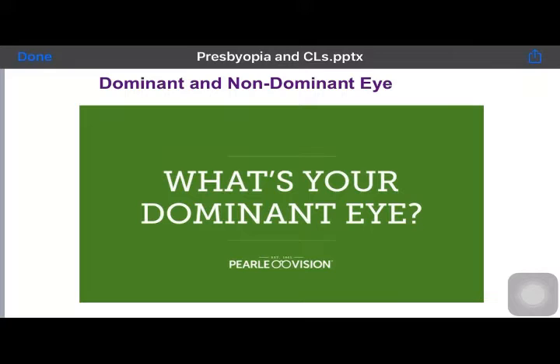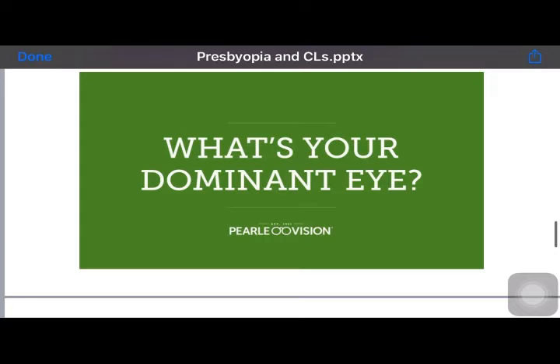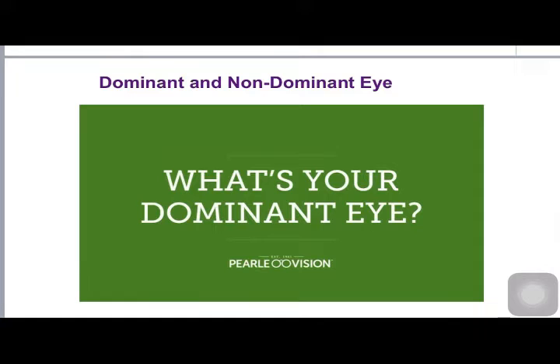So unfortunately, there was a video, but I think it will not play on my mobile, so I will not be able to show you this video over here. But it is very easy. You can just go to Google and check how to find out the dominant and the non-dominant eye. They will ask you to make a triangle with your hand. They will ask you to see a distance target with the distance correction on, and then cover and uncover the eyes. The eye with which you can see the image is the dominant eye, and the eye with which the image shifts is the non-dominant eye.